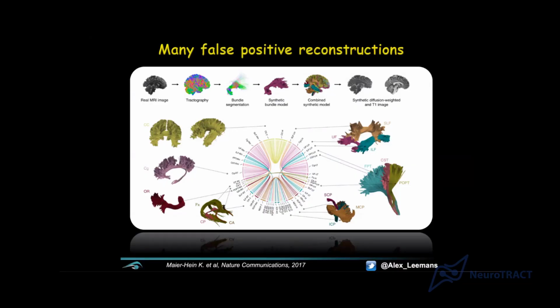Knowing that the uncinate fasciculus, this hook-shaped pathway, connects the temporal pole to the orbitofrontal cortex is something that we know from these dissections, right? So we can learn from that and then see whether it looks the same. But it's very hand-wavy. The actual validation is still ongoing research. To date, this is the only in vivo technique that can virtually reconstruct pathways. Okay.